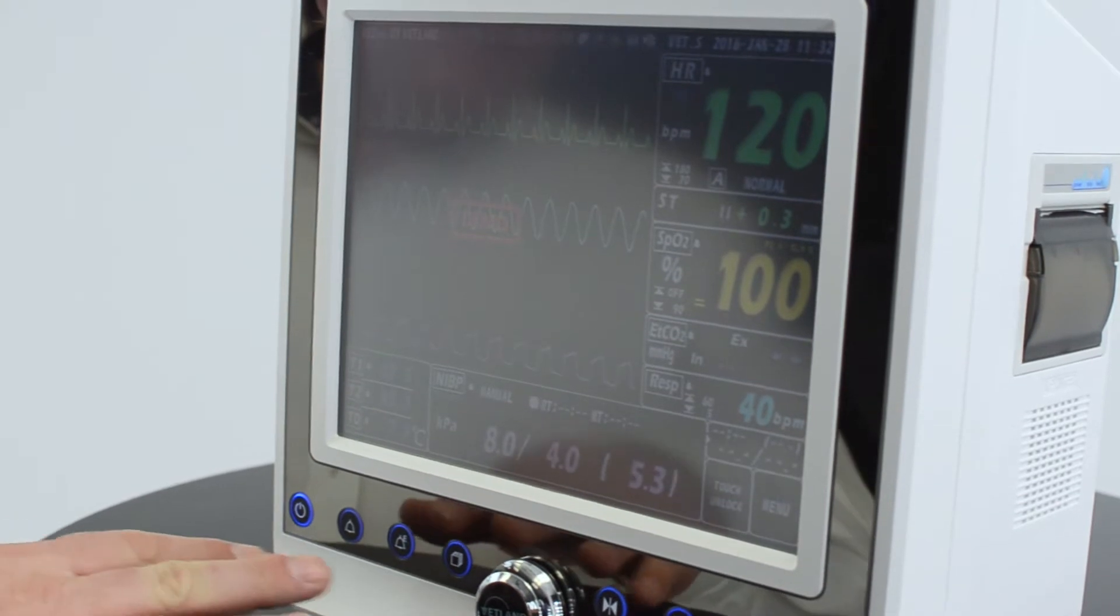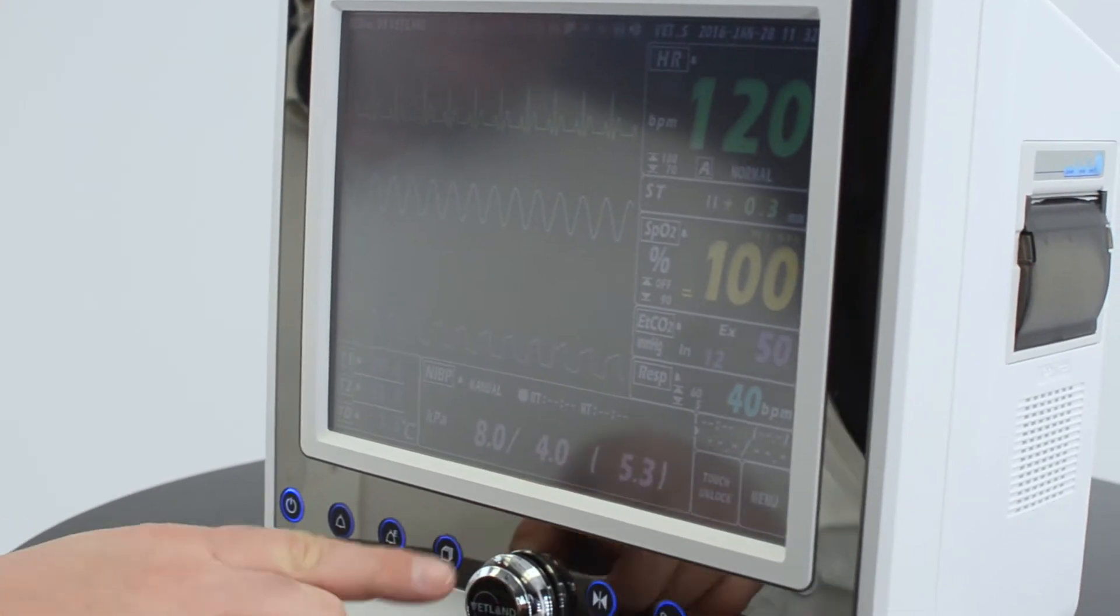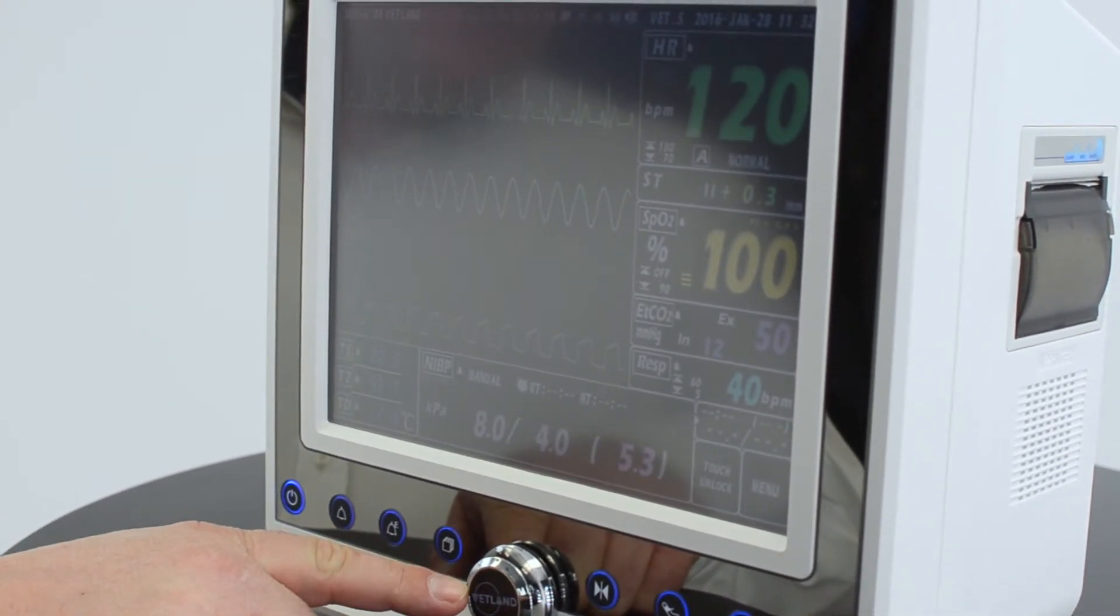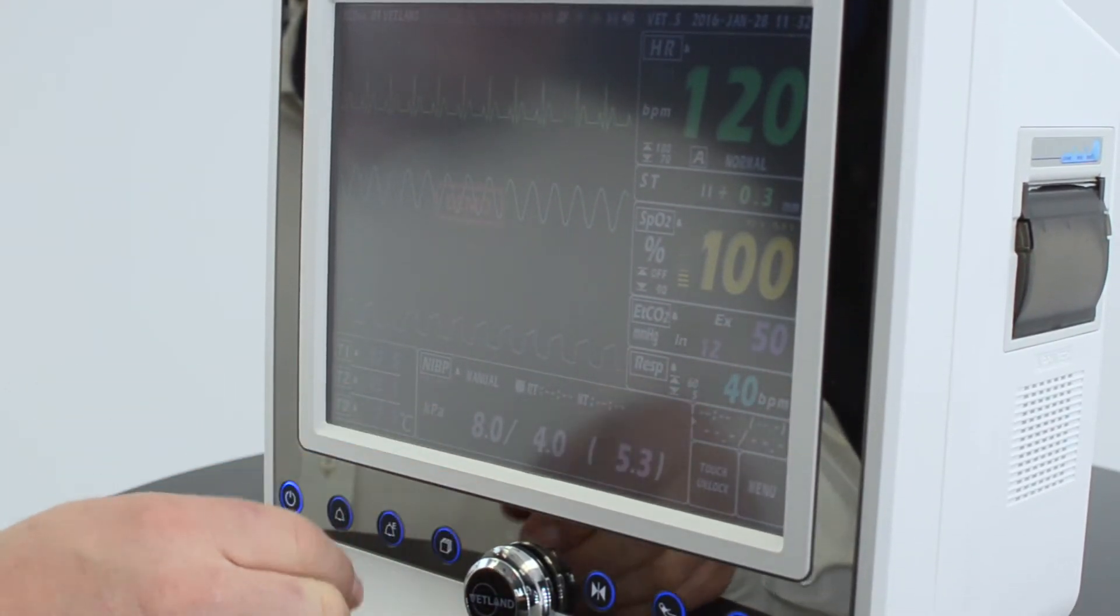There's two ways to navigate on the screen. One is with the trim knob. The other is with the touch screen.